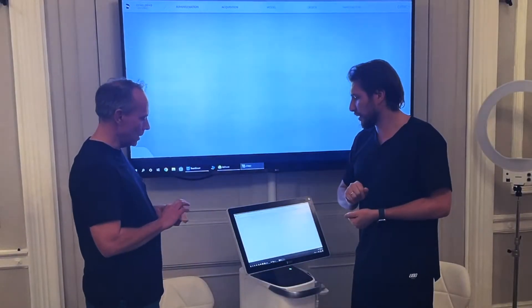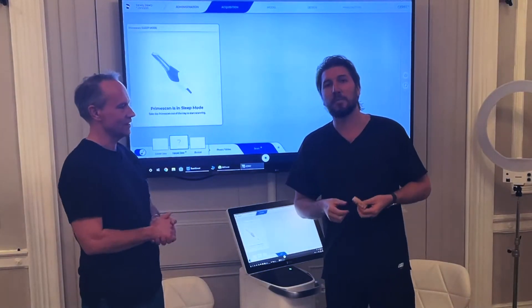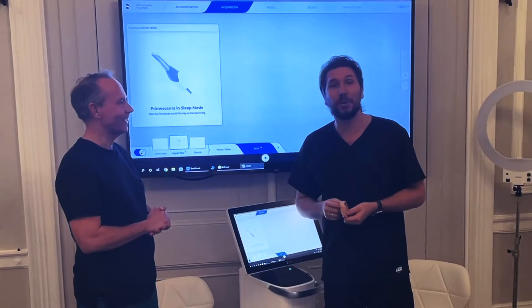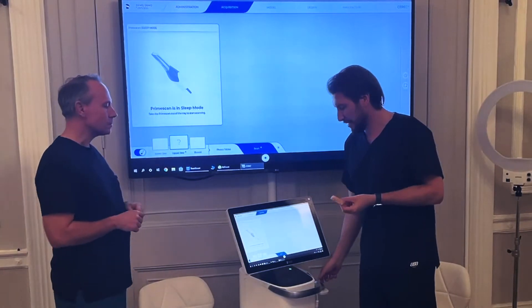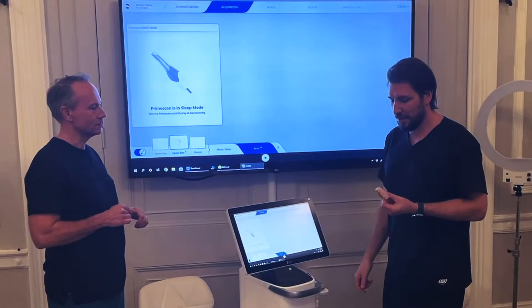Let's go. We have this printed model here which will illustrate our little friendly patient. He's got a big mouth and no lower jaw, which makes life very easy. So let's scan now — I'm going to hold this from behind just like this patient here.